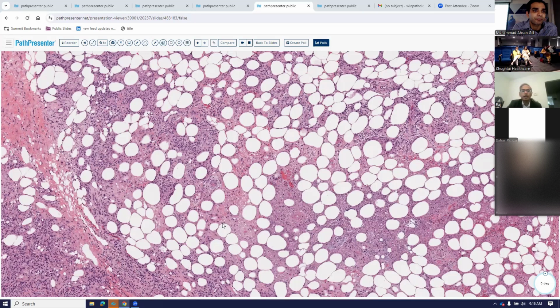Can you please repeat how to diagnose pre-bullous BP actually? Okay. So in the pre-bullous BP, like I said, you're going to see the superficial and mid-dermal perivascular infiltrate with eosinophils. But the other classic feature that I've always seen is this eosinophilic exocytosis. So you start seeing eosinophils also within the epidermis and sometimes even lining up the dermal epidermal junction. If you start seeing those in the epidermis, then you definitely have to think that most likely I'm dealing with the urticarial or the prodromal phase of bullous pemphigoid.